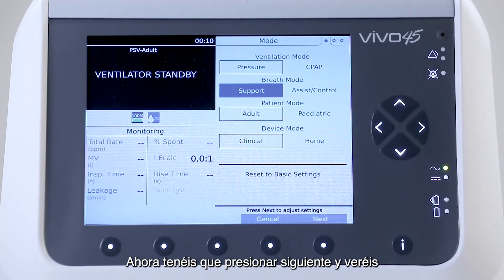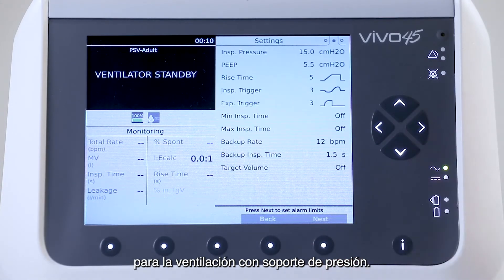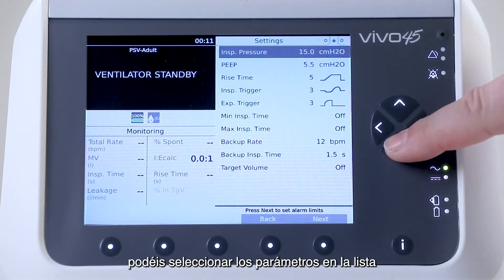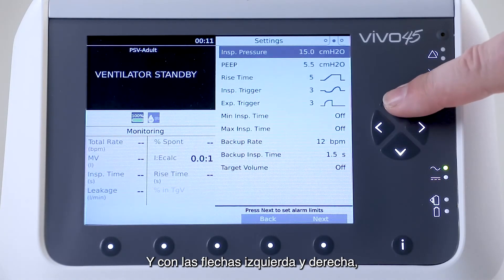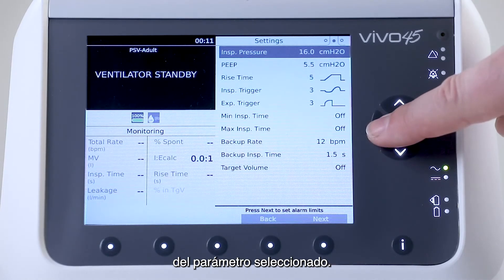Now you have to press next and you will see all the settings that are applicable for pressure support ventilation. With the up and down buttons, you can select the parameters in the list that you want to change. And with the left and right arrows, you can decrease or increase the setting for the selected parameter.